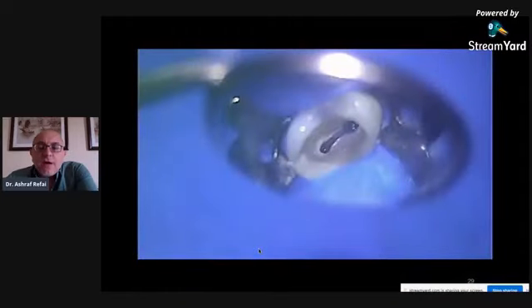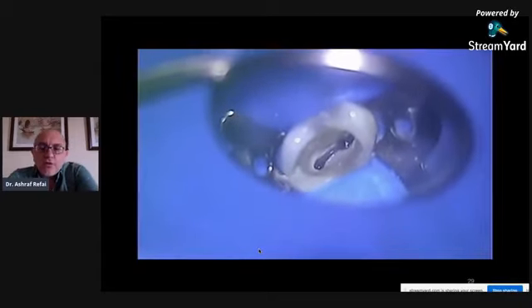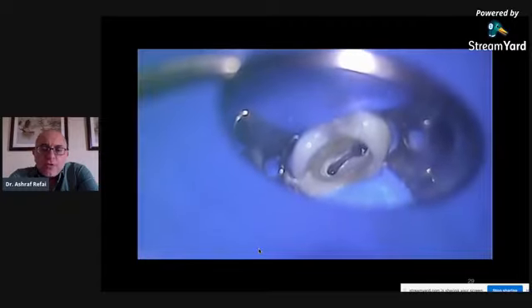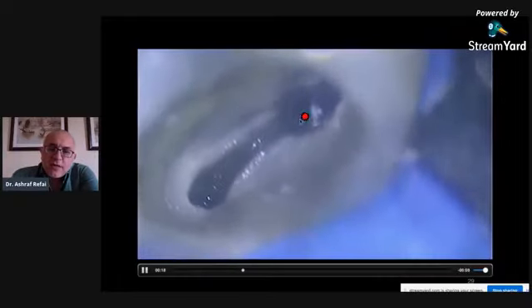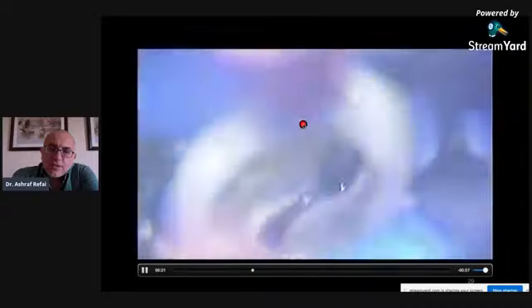Okay, so here you have another case. I'm going to show you the video of a tooth. There you go. This was an upper premolar, which a doctor referred to me with an instrument fracture in the buccal canal. And you can see that after some effort, I managed to bypass that instrument. You can see the space between the instrument and the canal wall. And here you can see an instrument inserted in this space. That's a size 25. So I actually managed to enlarge the canal to a size 25.